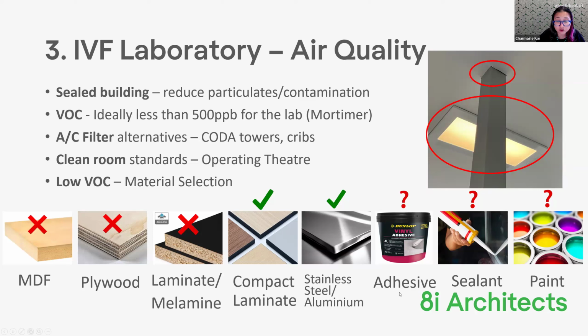And bring out your trusty VOC meters and test the materials. Generally we will do up prototypes. So we'll have a prototype of floor vinyl with adhesive, and we'll test that to make sure it gets to a point where the VOC levels are acceptable, because the level that you're aiming at, that 500 parts per billion, is for the whole lab, not necessarily just for that one material. And you can get adhesives that are astronomical. And you can smell it. As soon as you can smell it, you know that it's well above what you would want in there.